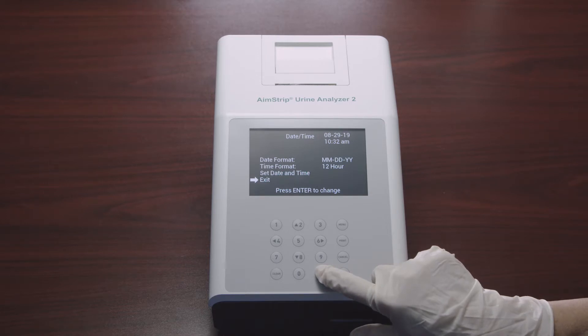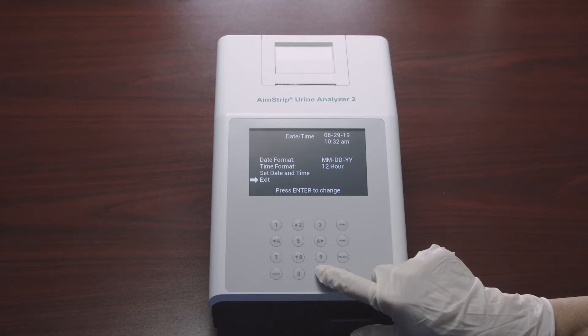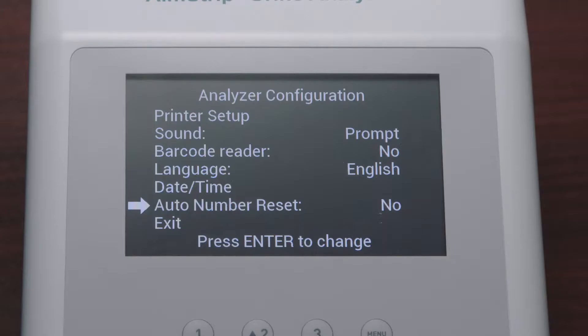Once done, press Enter to save changes and exit, or press Cancel to discard changes — either key returns you to the previous screen. Make sure the date and time setting is correct based on the date format and time format selected. The last option in the Analyzer Configuration is Auto Number Reset: select it and press Enter to cycle to Yes or No. Selecting Yes resets the test number each day; selecting No leaves the test number unaffected by the date. Once done, select Exit to return to the menu screen.